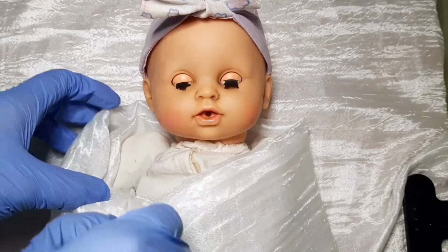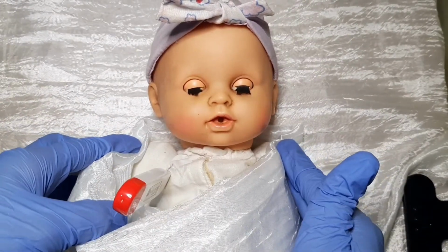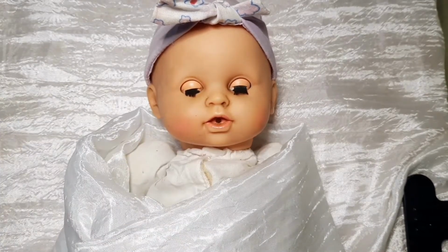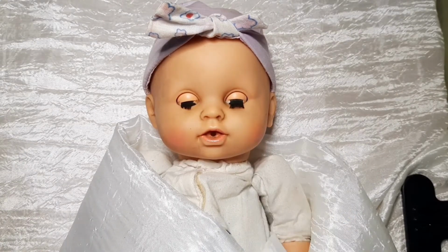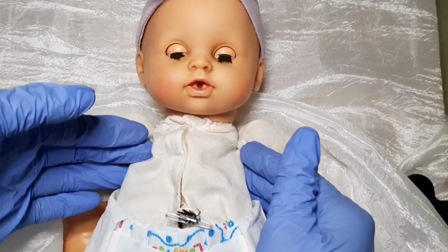Now I will check the newborn's vital signs by getting the axillary temperature, inspecting and auscultating the lung sounds, respiratory rate, and the apical pulse, and we will also get the blood pressure of the patient. But we can only get the blood pressure of the baby by using the Doppler stethoscope.